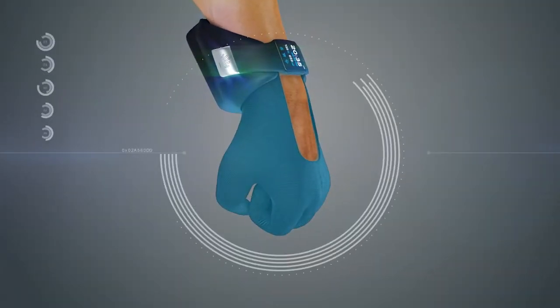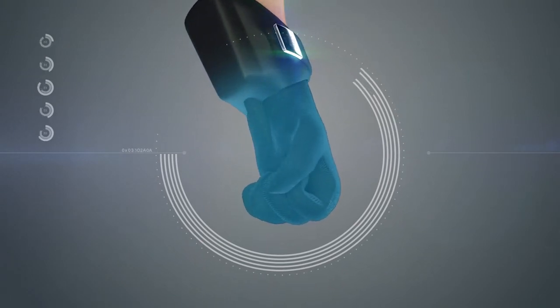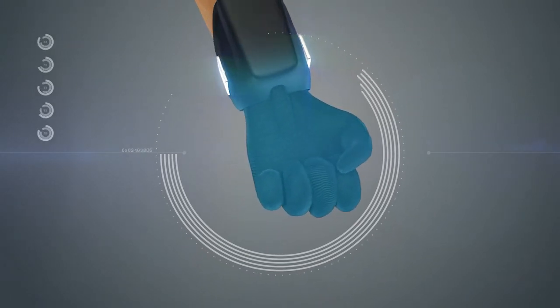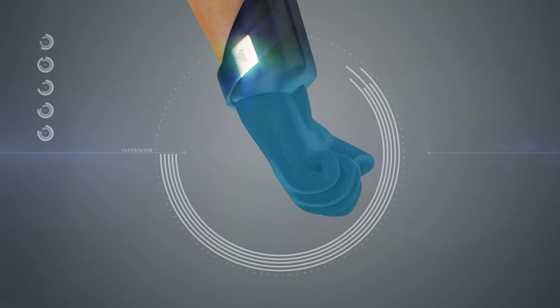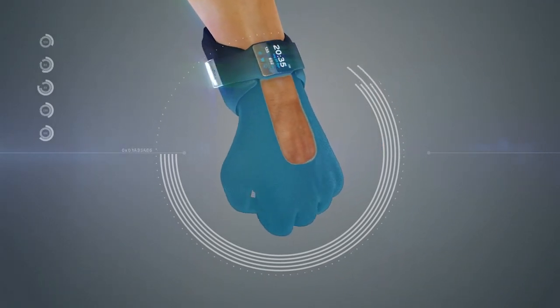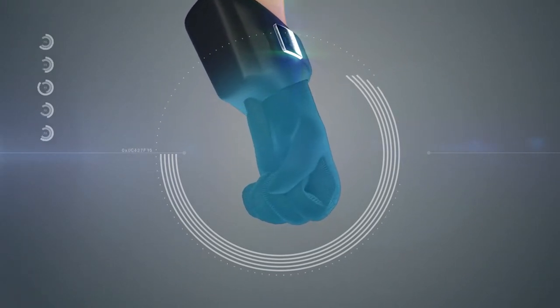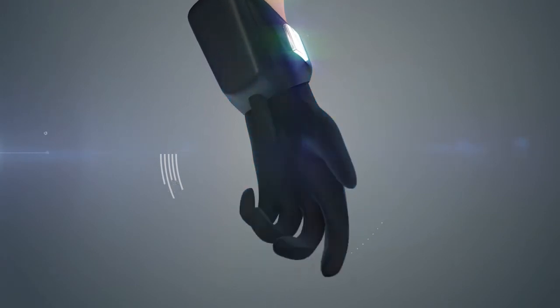Our system doesn't move the user's fingers in any way. This ensures compatibility with different needs. Several safety features are also present in the glove. For example, when too much force is transferred to the glove in a short period of time, the system triggers a mechanical release mechanism, thus keeping the user safe at all times.